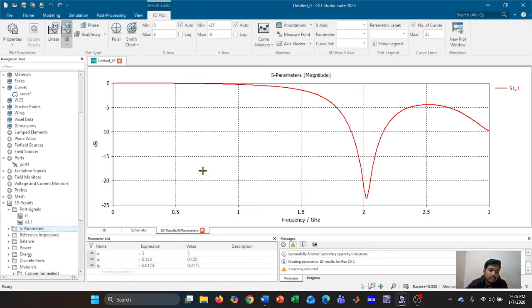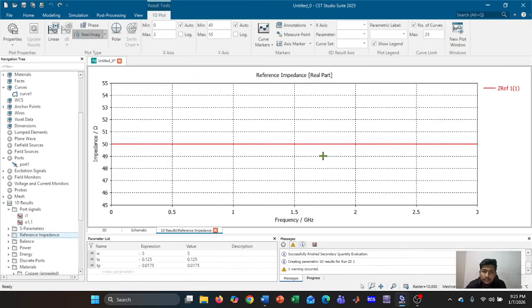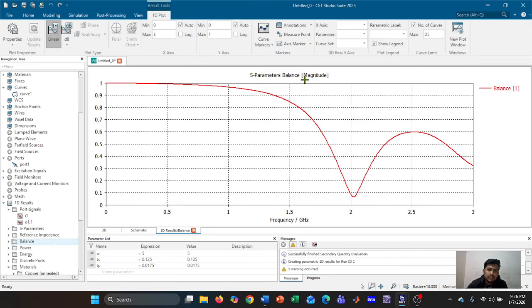So then the reference impedance. This graph just shows that the antenna is tested using standard 50 ohm systems, which is normal for RF antennas. It confirms that my simulation setup is correct. We see the balance, S-parameters, balance, magnitude. This graph shows whether the antenna is excited properly and evenly. The best balance happens near 2.1 gigahertz, where the antenna works best. A balanced antenna works more reliably and stably.